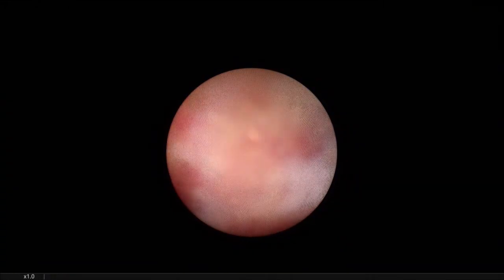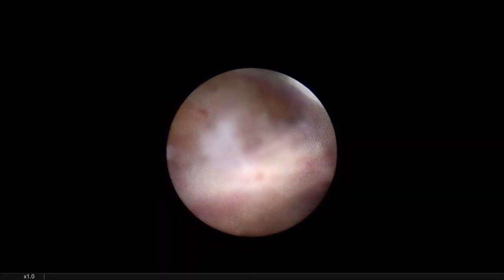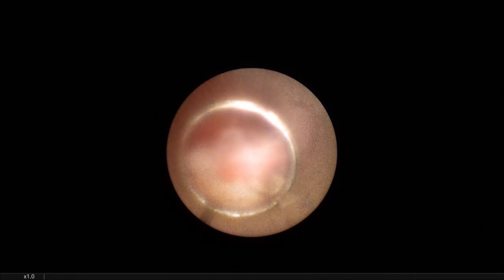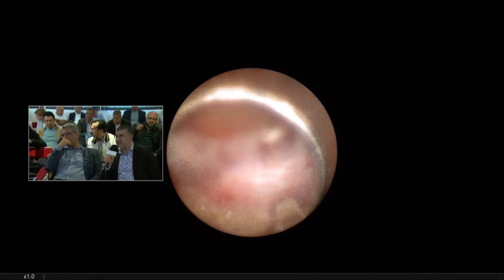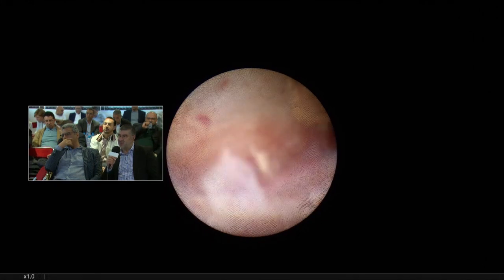Yes, we had a question here in the room. Would you try to relocate the stone in the pelvis, the renal pelvis? It will be easier, no?